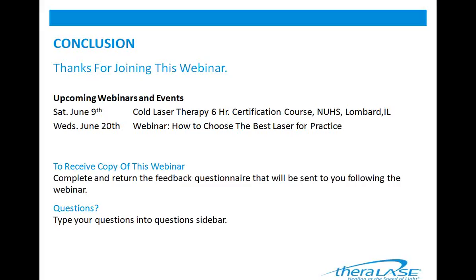It's basically sound waves impacting the injury site, and it can be very tender. A lot of my patients who are undergoing shockwave therapy, for example for a shoulder injury or a shoulder tear, I let them know that you're going to leave here feeling discomfort for the next couple of days, and that pain should then resolve slowly.